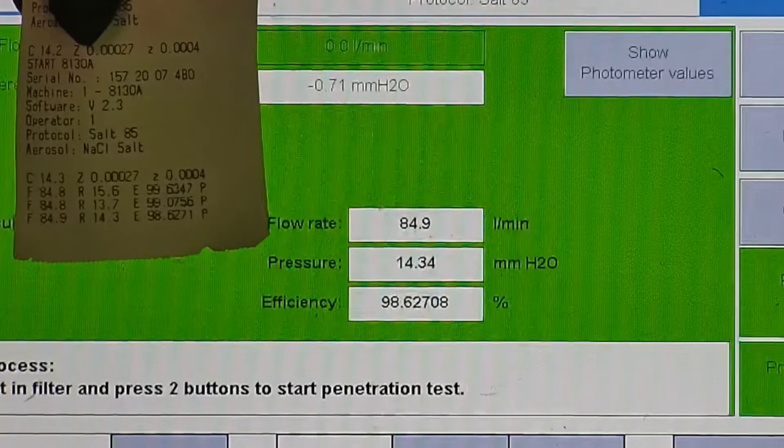F stands for air flow rate, which we test at 85 liters per minute. R is for resistance, also referred to as pressure drop — this correlates with breathability, so the lower the number, the more comfortable and breathable the face mask is. E stands for filtration efficiency percentage. The filtration percentage for all three respirators was 98.63% or higher.